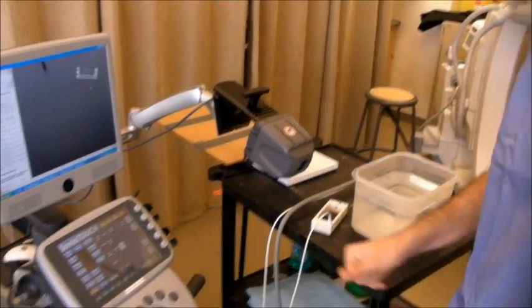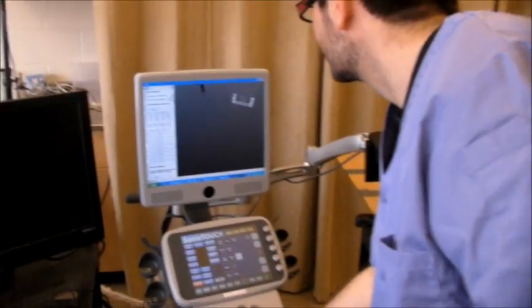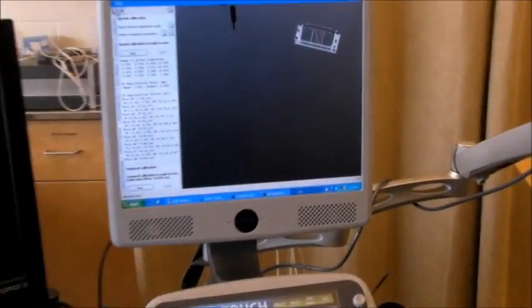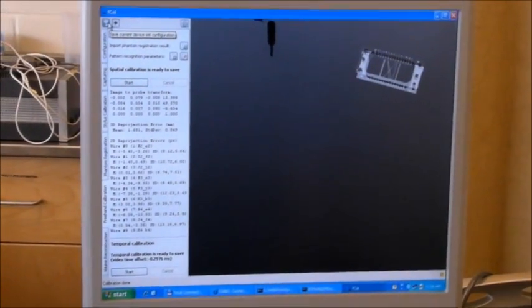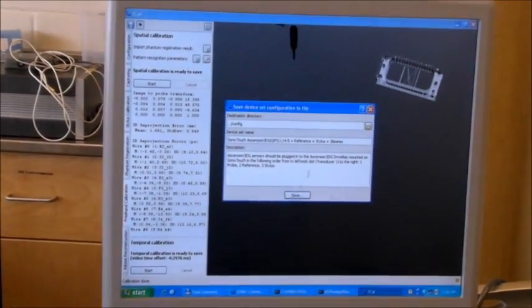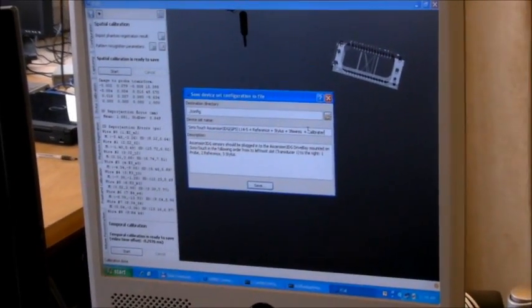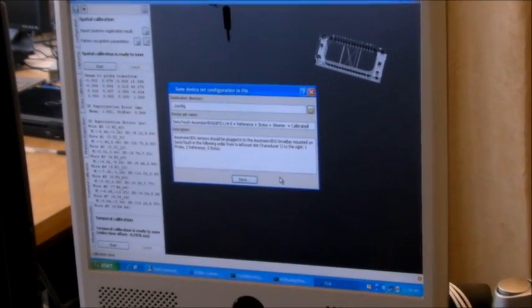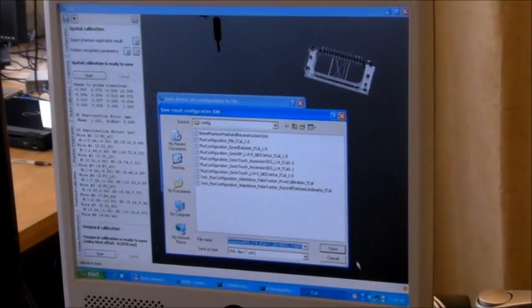Now, I want to save the calibration results, because I want to use it for acquisition and volume reconstruction. I click the save. Now I click save.